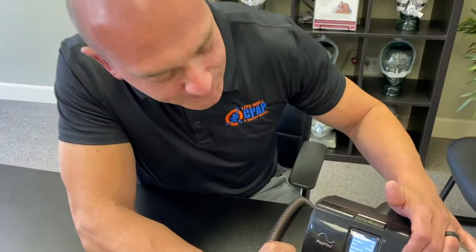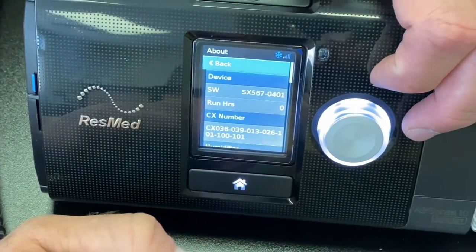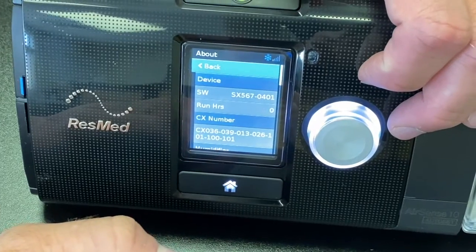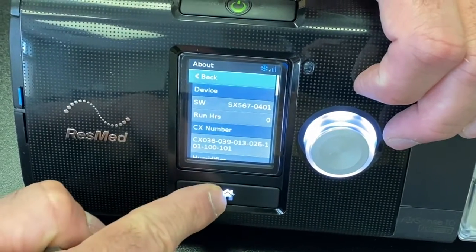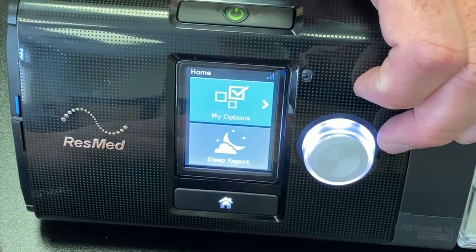Your mask seal will show either a green smiley or a red frowny face. If you scroll down, you get more detailed data. There's also a little app you can get for this machine — the MyAir app from ResMed, available for Apple and Android — which guides you through your usage on the machine.